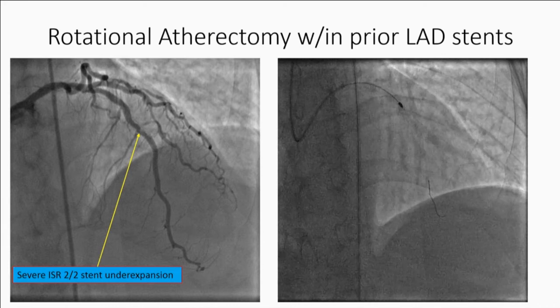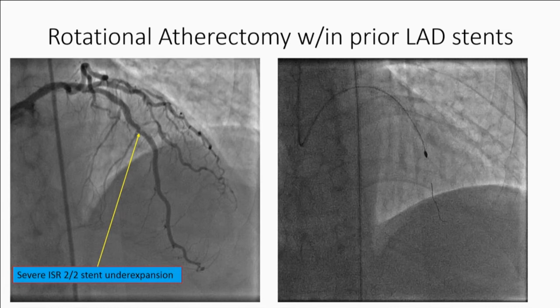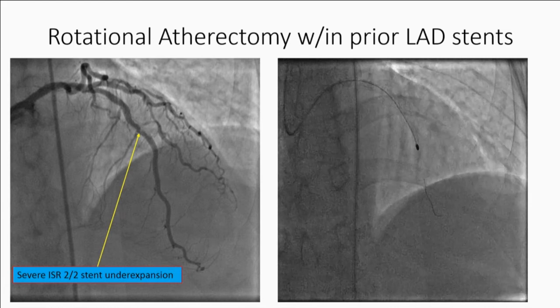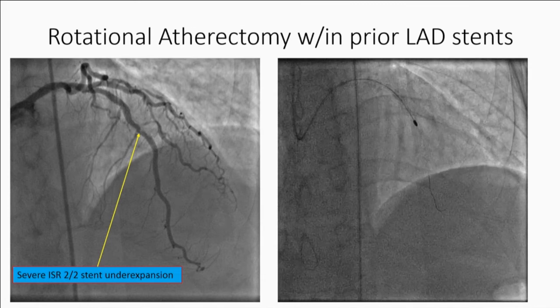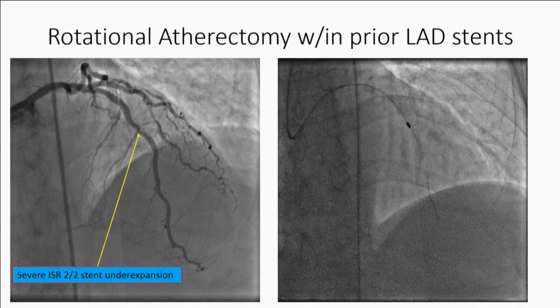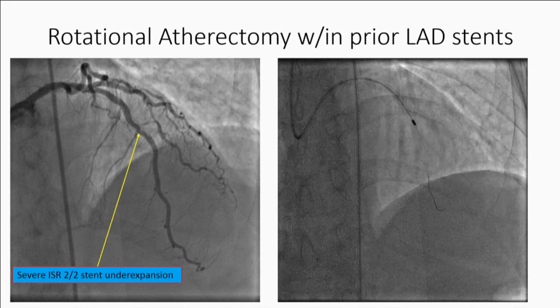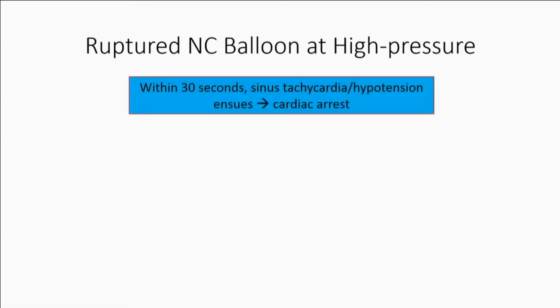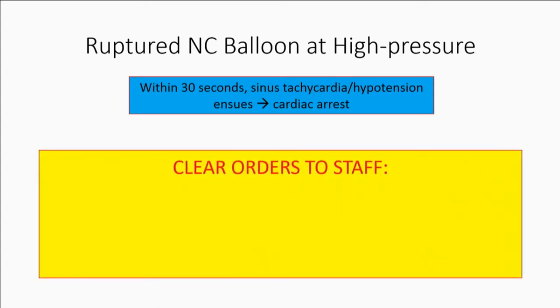This is my partner's case from last month — a patient who had underexpanded stents in the mid-LAD presenting with rest angina and severe restenosis. Rotational atherectomy with a 1.75 burr was performed within the stented segment with a good ablation result. Because there was still a resistant lesion, high-pressure balloon inflation was performed and the non-compliant balloon ruptured. When the balloon was deflated, there was a clear injury at that segment. Within 30 seconds the patient became very tachycardic and hypotensive, and cardiac arrest happened. This is where things have to move very quickly — your balloon has ruptured, so you can't just re-inflate it. You have to get that balloon out, get a new balloon, and move quickly.